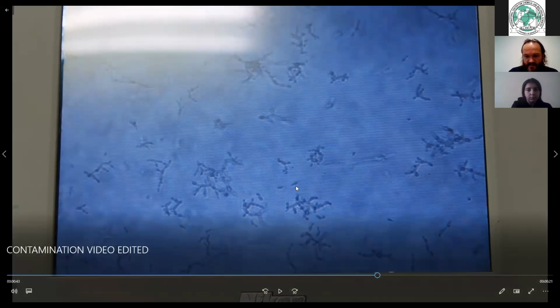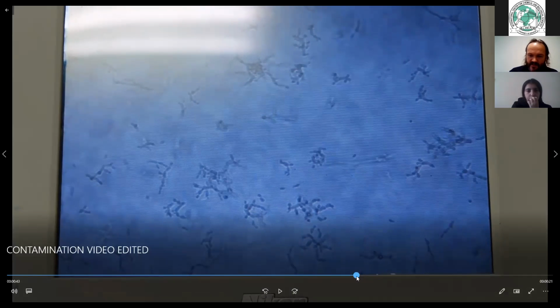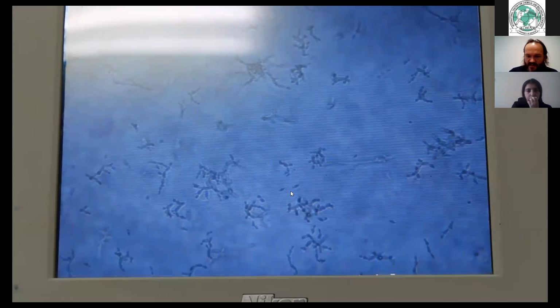In the yeast, there's also slight movement, some vibration, but you can see the yeast, first they're bigger, and they make these specific structures like trains where you have the single train compartments. This is when they divide, the yeast cells, but then they stay attached. And if we go back to the beginning of the yeast video, you will see some slight vibration here, but it is by far less than you have in the bacterial contamination, where they're jumping like crazy.